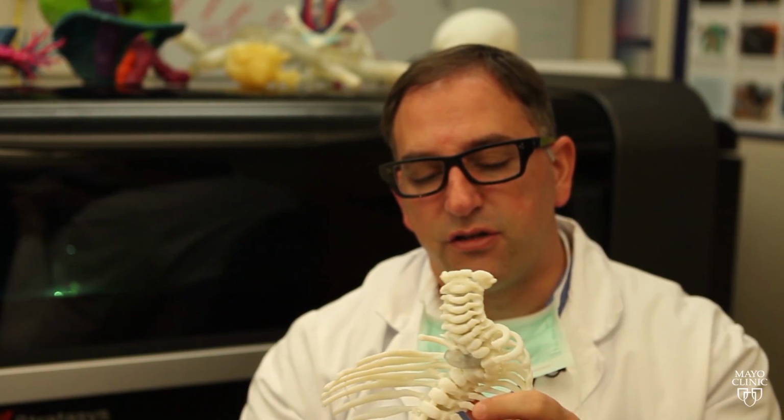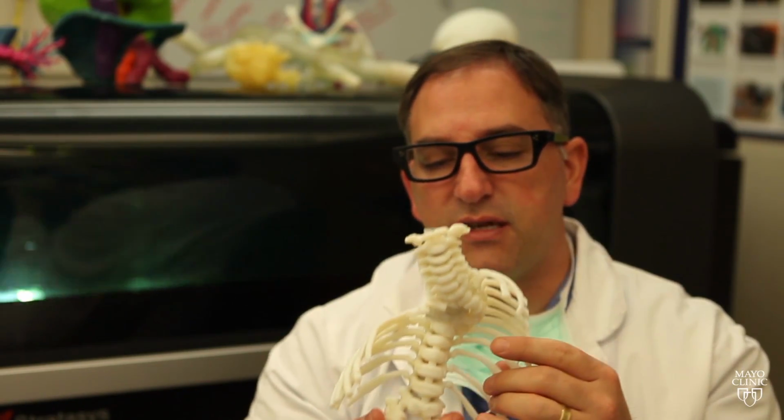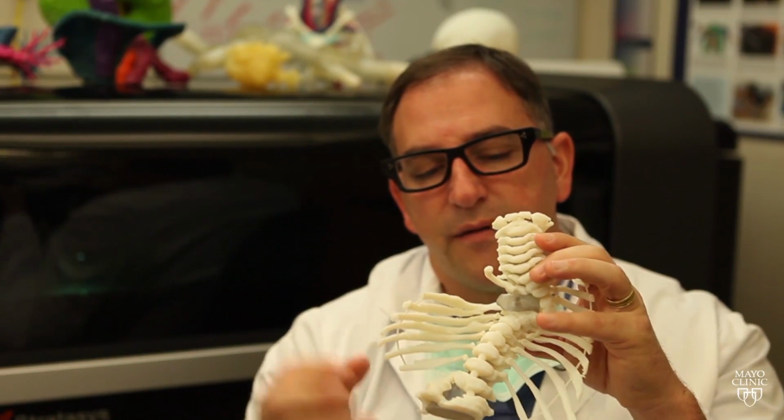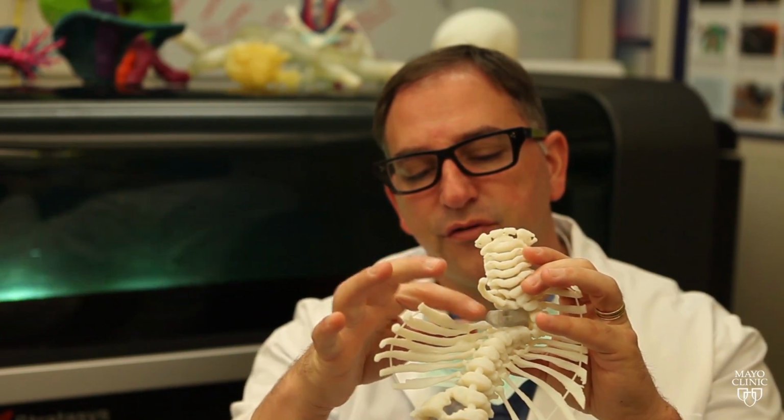Whereas if you give the patient a model, it allows them to physically hold their own bones, for example, outside their body, but it allows them also to understand why the surgeon might have to cut somewhere or what some of the risks are, what the benefits are. So if you took something complex like this model here, this is a congenital scoliosis case, which is complex. You can see the ribs are malformed on one side. You can see that the spinal cord is coming out through the side.